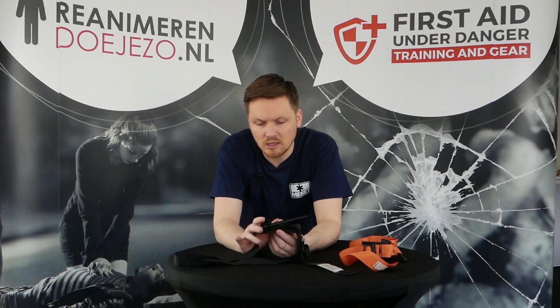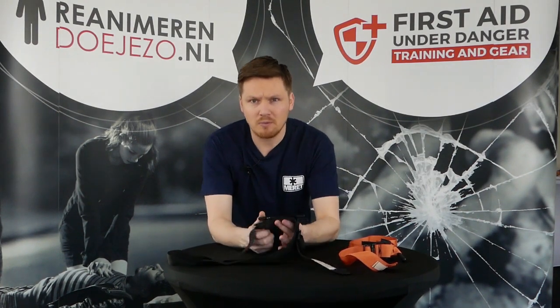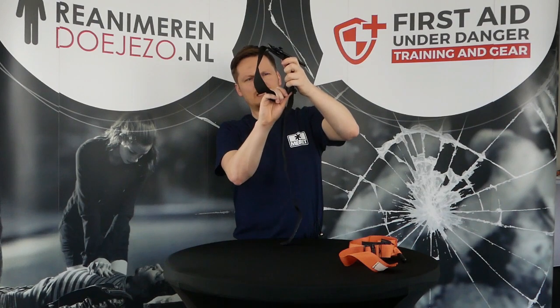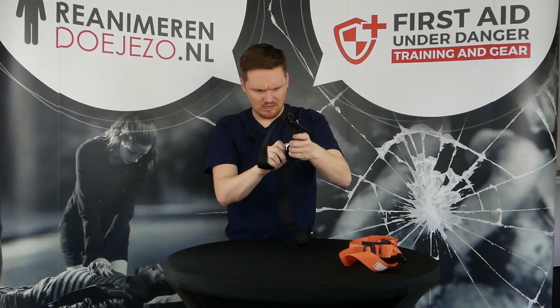So that is something that I do still miss for the soft tourniquet, but let's see how easy it is to get this tourniquet on for self-application. So first, we don't need it as big as it is right now. We need it, what they say is make it about the width of a hand, so a little bit more.